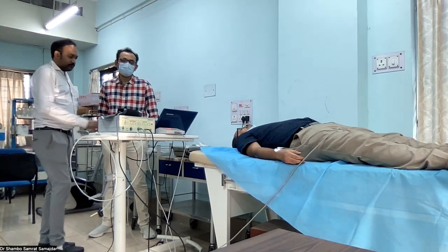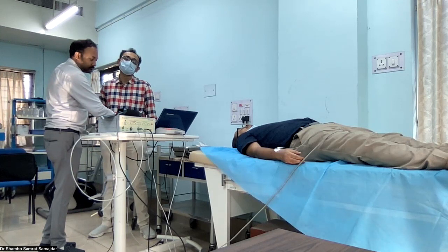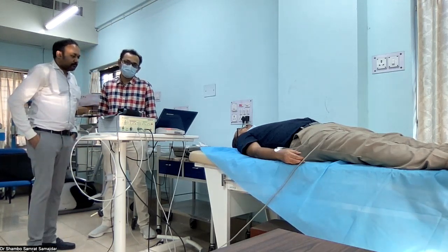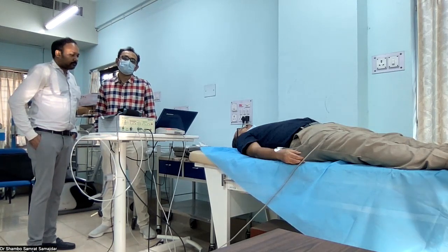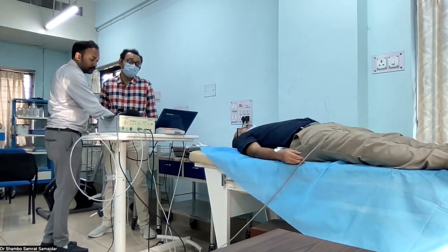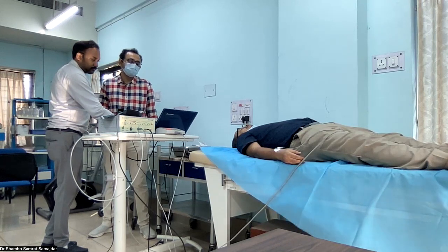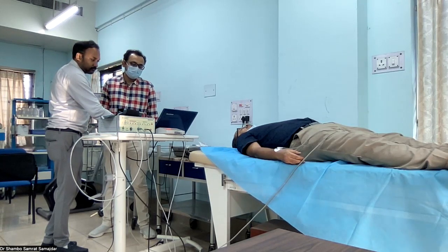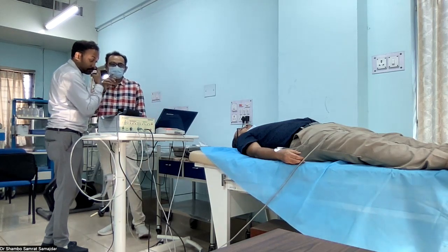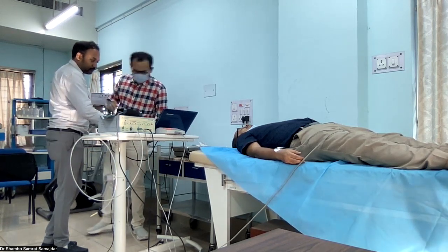If I have cardiac autonomic neuropathy and I am taking some drugs which can prolong QTc, then in presence of cardiac autonomic neuropathy, we will have a more chance to get torsades. So this is why it is a very important test, and already the test was completed. Let's see the results. We'll just check the results now.